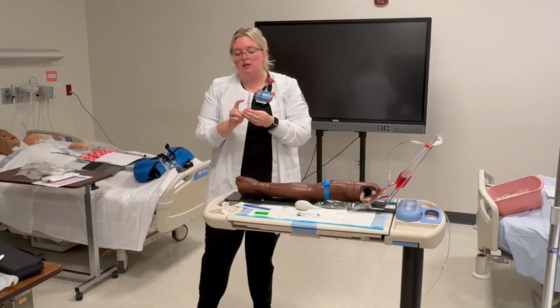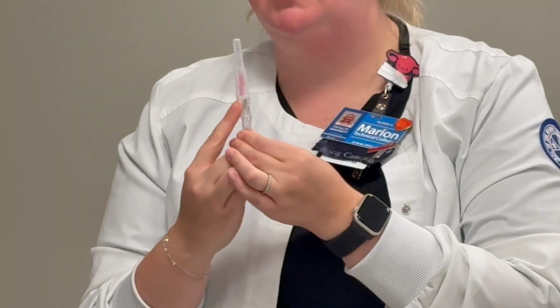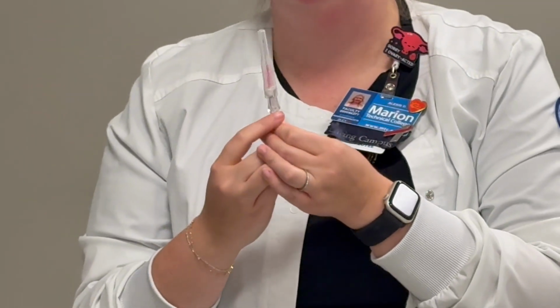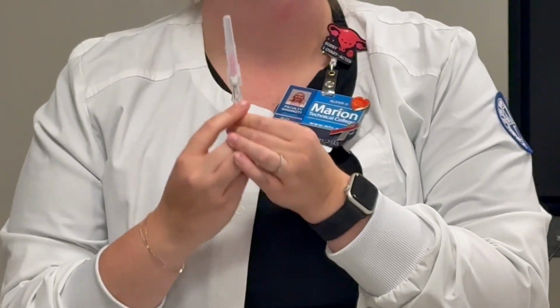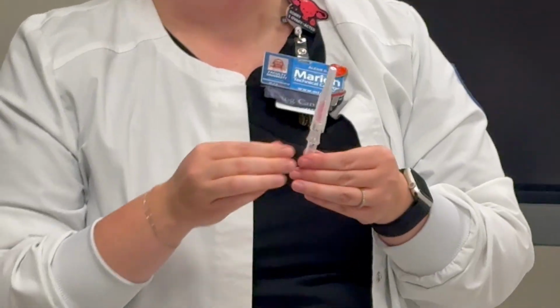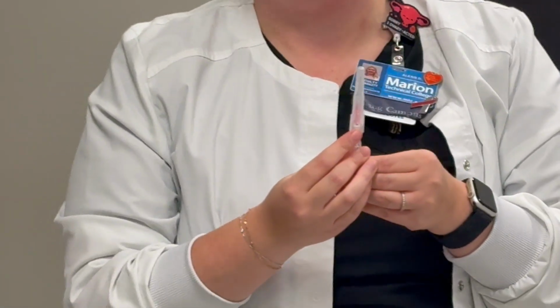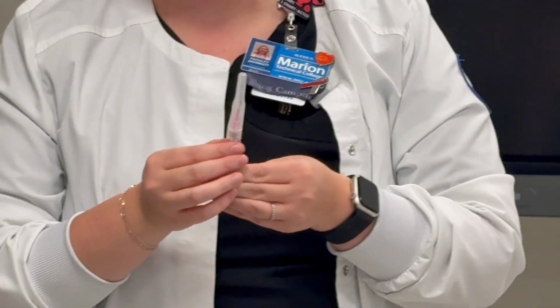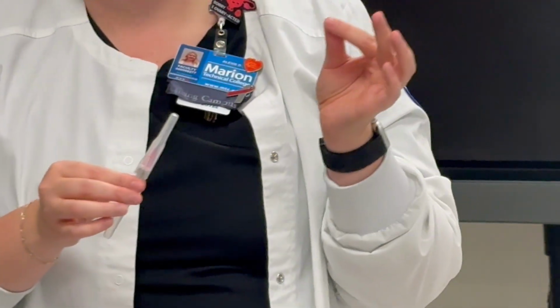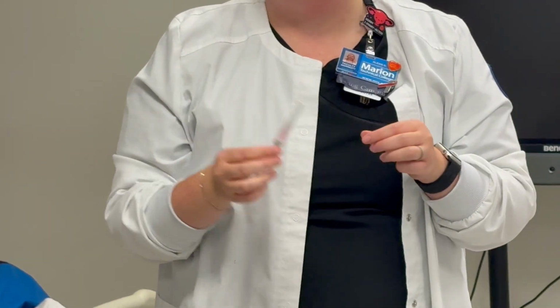These IVs, see this white button right here? That is your safety. You may encounter different looking IVs. It's extremely important that before you even get near a patient with a needle that you know how it works. You don't want to be figuring it out when you're one-handed at the bedside by yourself. Okay, so this particular IV has a button that initiates the safety. And a lot of times you guys, when you go to take this off, you accidentally press the safety, which is totally fine. Nobody's hurt, but just know that that's where it is, okay?